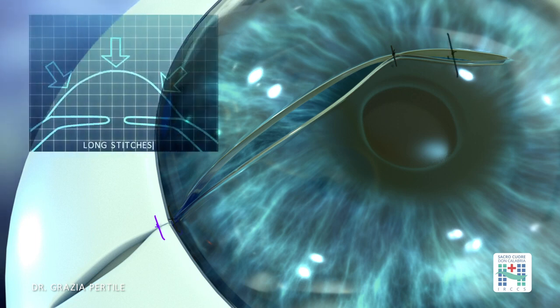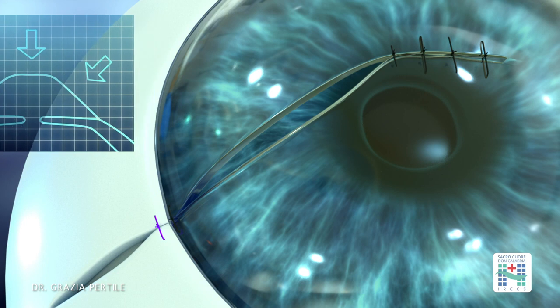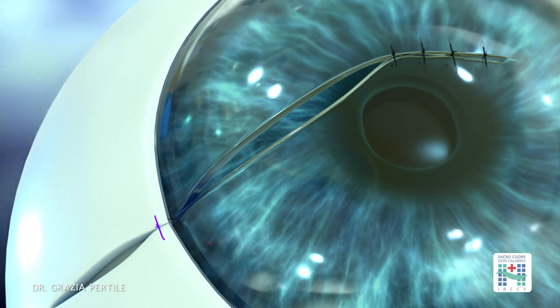If long sutures are placed at the center, they tend to flatten the apex and induce significant irregular astigmatism, in addition to increasing the area of scarring.